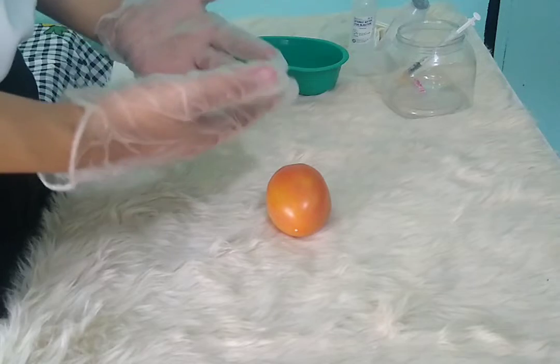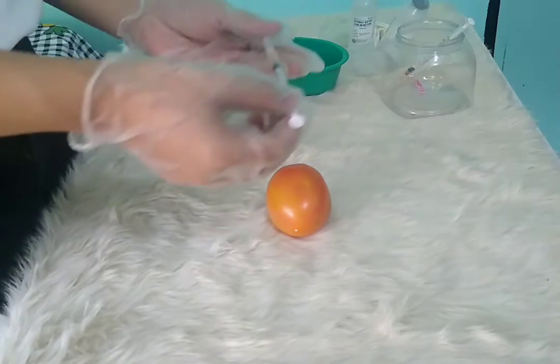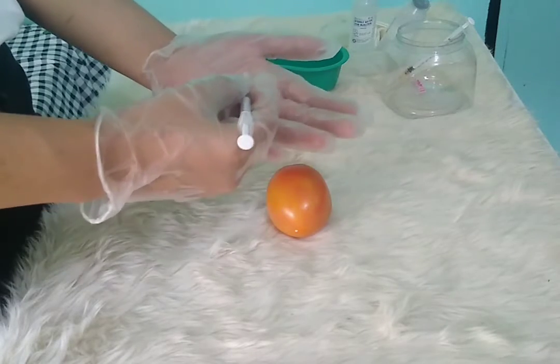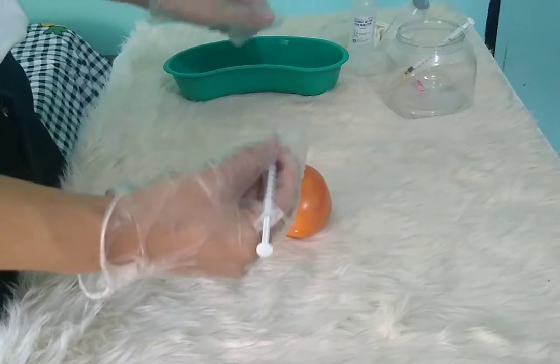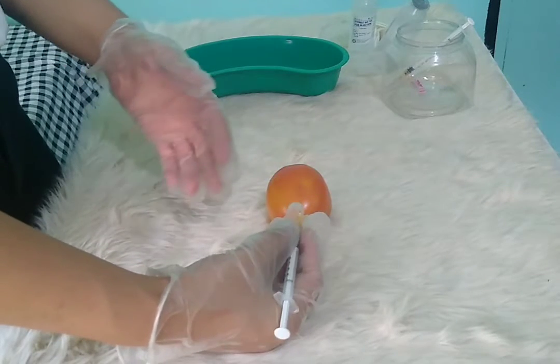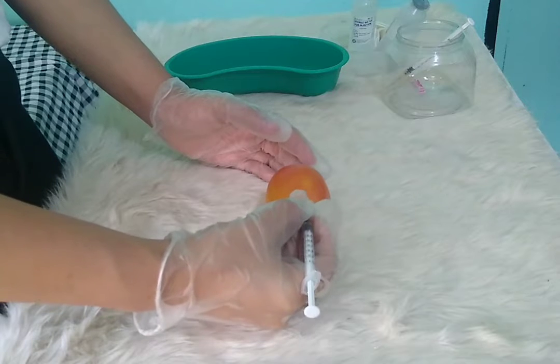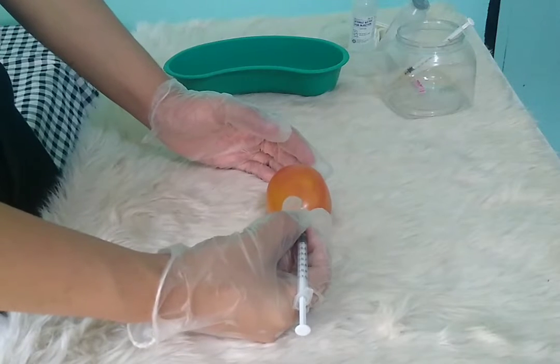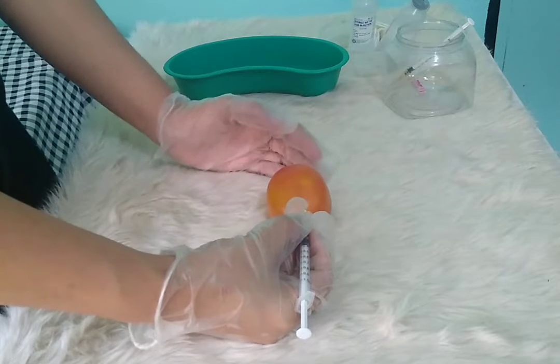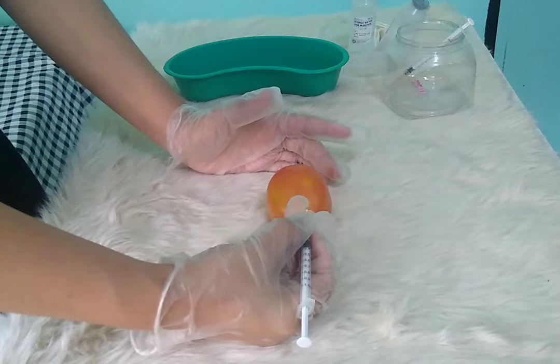We can prepare the syringe for injection. Remove the needle cap while waiting for the antiseptic to dry. Expel any air bubbles from the syringe. Grasp the syringe with the dominant hand close to the hub, holding it with the thumb and the forefinger, almost parallel to the skin with the bevel of the needle up.